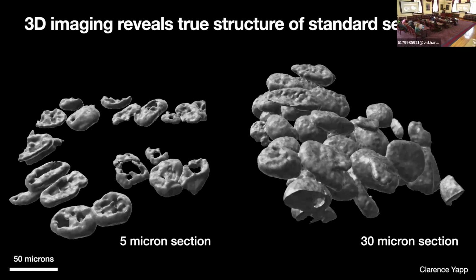And we didn't think about this too much, or maybe we kind of ignored it, but at 5 microns, you're not getting any single whole nucleus. So you can see each of these nuclei is just shaved across the top and the bottom. So if you're not getting a whole nucleus, you're not getting a whole cytoplasm either. Furthermore, what about the cell that was above or below? That empty space might have cytoplasm of some other cell in it.